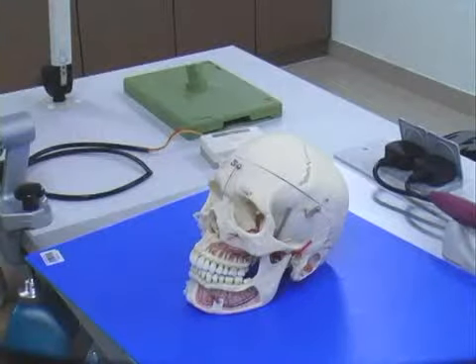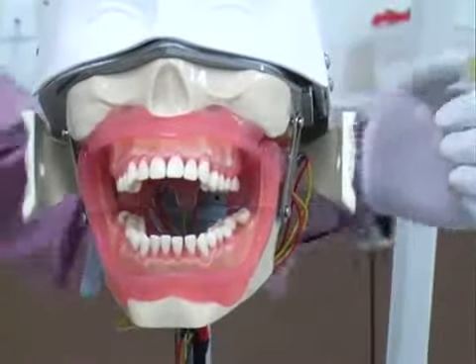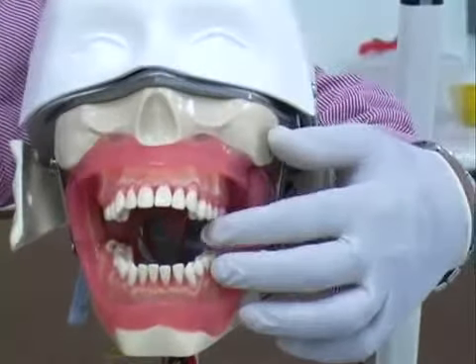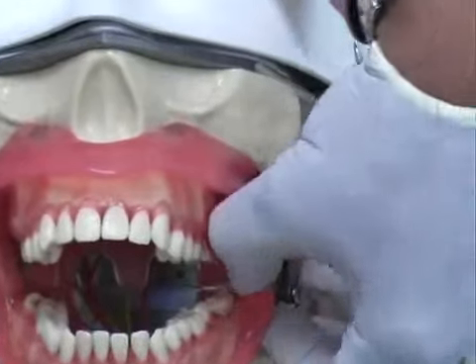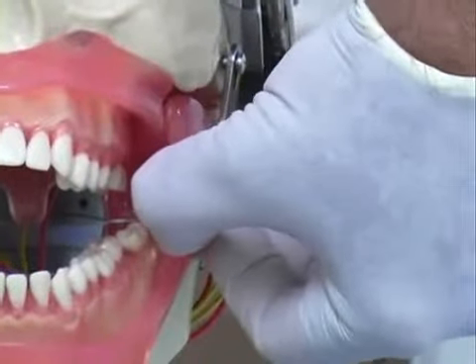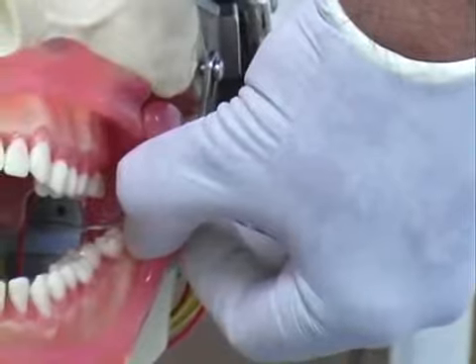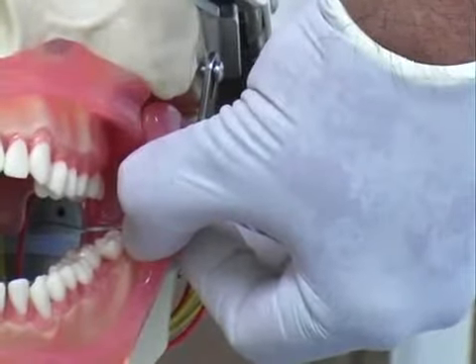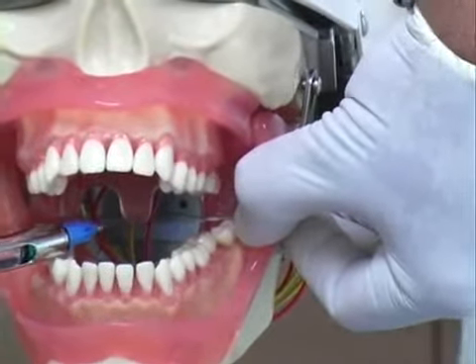Move now to the mannequin model for the administration of inferior alveolar nerve block. This is a mannequin model which we are going to use. Here you can identify the coronoid notch where the thumbnail should be put, while the barrel of this syringe is lying on the opposite side of the premolar.